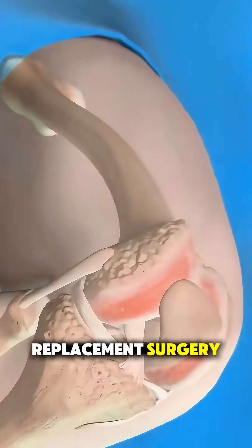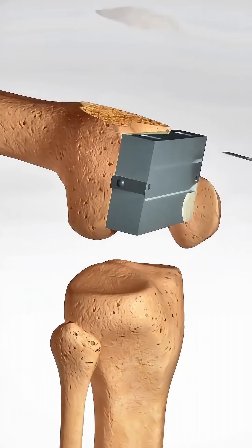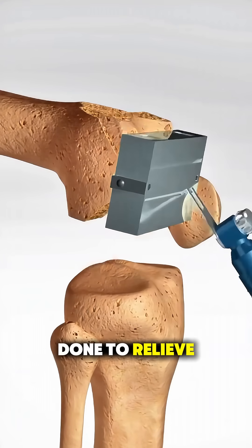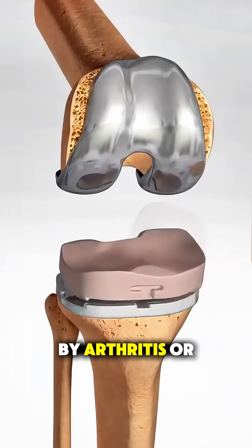Ever wondered how a total knee replacement surgery is actually performed? Let's walk through it in just a minute. This procedure is done to relieve pain and restore movement in a knee that's been damaged by arthritis or injury.